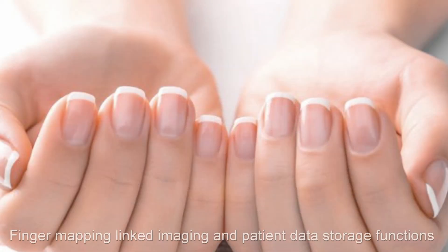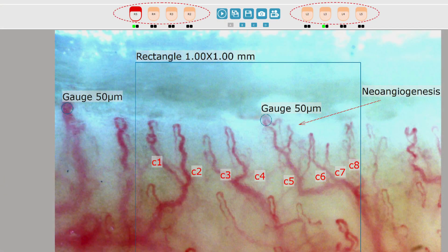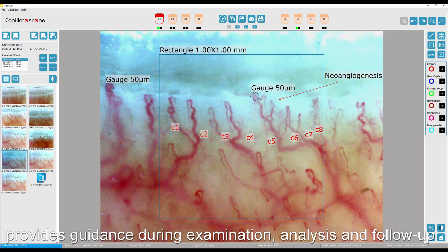Finger mapping, linked imaging, and patient data storage function provides guidance to the doctor during the examination, assessment and follow-up.